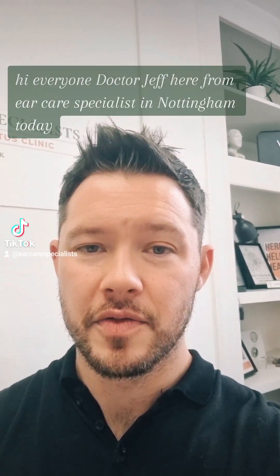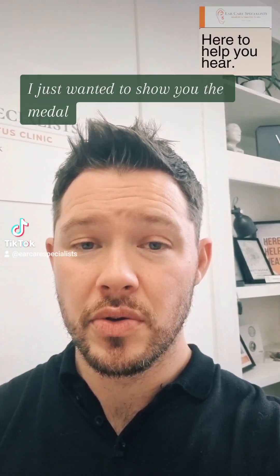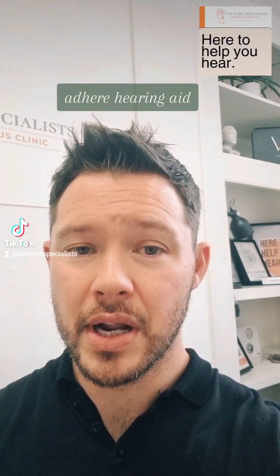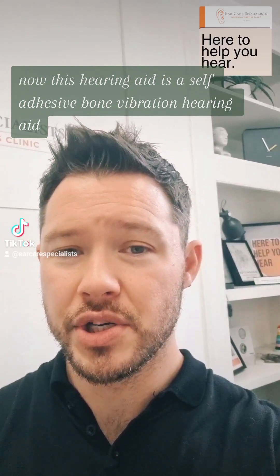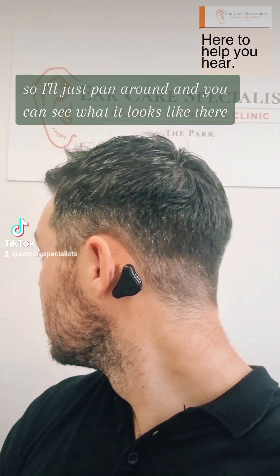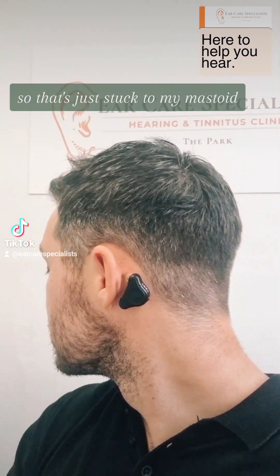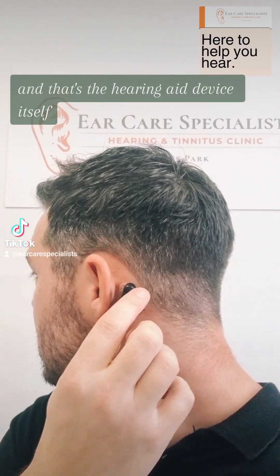Hi everyone, Dr. Jeff here from Ear Care Specialists in Nottingham. Today I just wanted to show you the Medel Adhere hearing aid. I'll just pan around so you can see what it looks like — that's just stuck to my mastoid, and that's the hearing aid device itself.